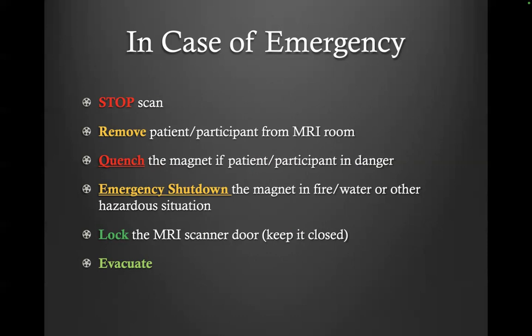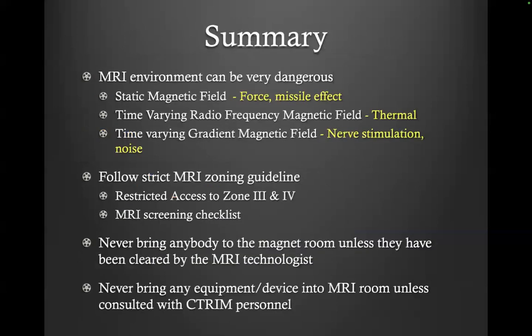And I should also emphasize, if it is a fire alarm somewhere, there's no immediate danger here, you just turn off your MRI, which takes 15-20 minutes, which is good, so that you properly save all your images so you don't lose your data. And then you lock your MRI scanner door and keep it closed, and then you evacuate.